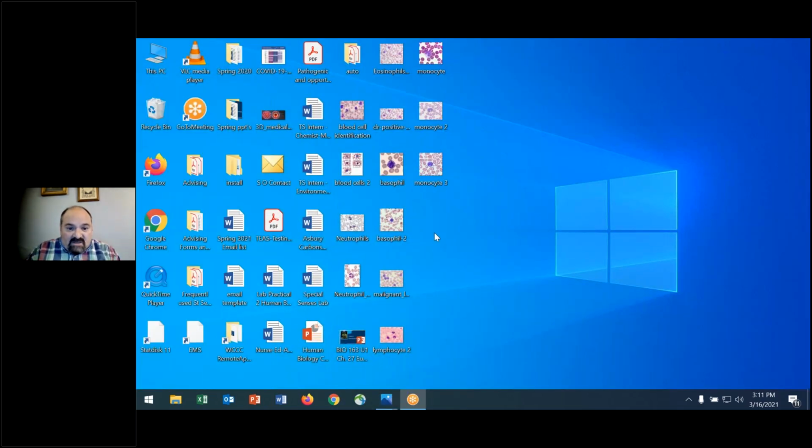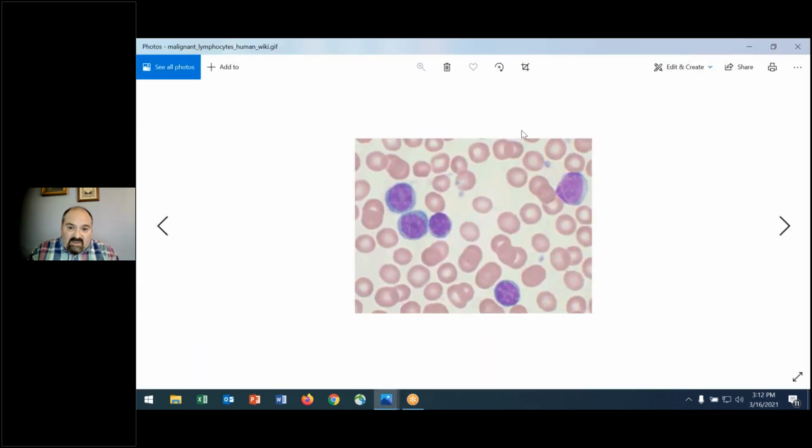Now let's look at some lymphocytes. In particular, we'll look at this image where many lymphocytes are demonstrated, and this is a result of lymphocytic leukemia. You're seeing that we only have a really small area of the cytoplasm that is viewed. Predominantly, the cell is made up of the nucleus, and it's oval in shape. Lymphocytes. Know that we have T and B lymphocytes, and we'll discuss them in greater detail when we look at the immune system and the lymphatic system.